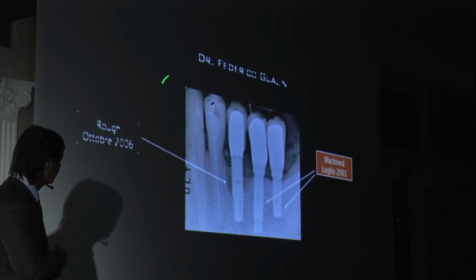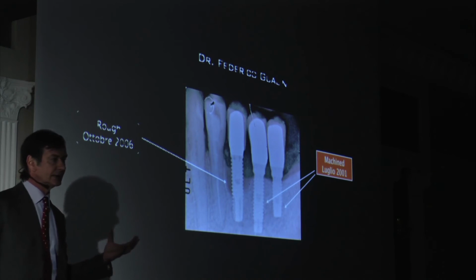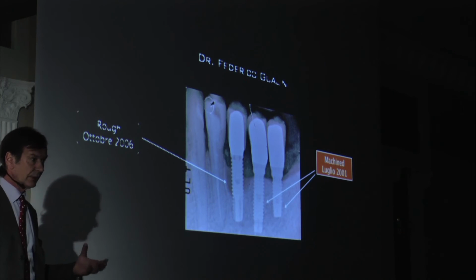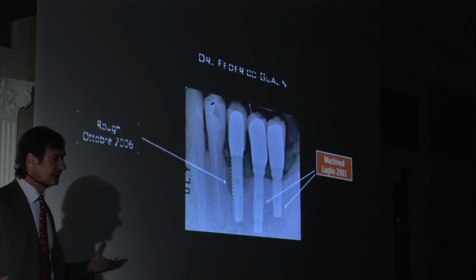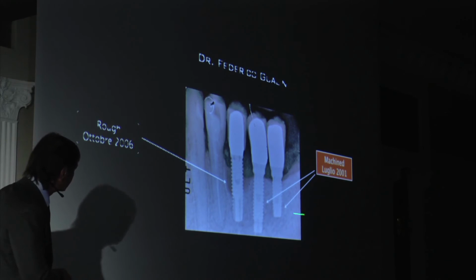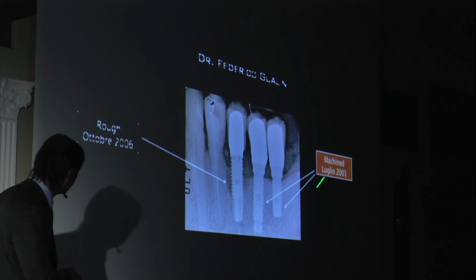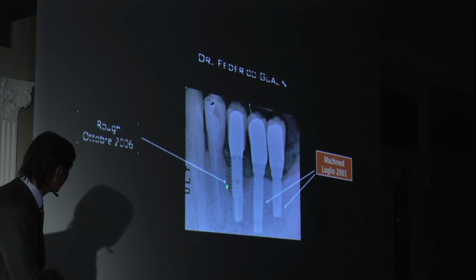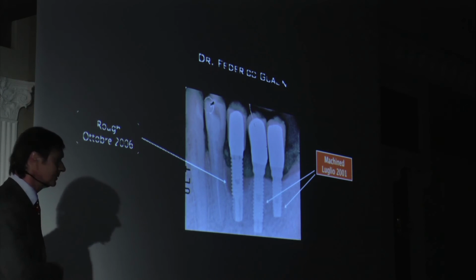This is Federico Gualini. He's one of the first dentists or periodontists that did osseointegration with me and with Polizzi in Italy in 1987. And he placed those 2 implants in 2001, machined. And this one was in 2006, much younger. But this is a rough surface implant in the same patient with the same surgeon.